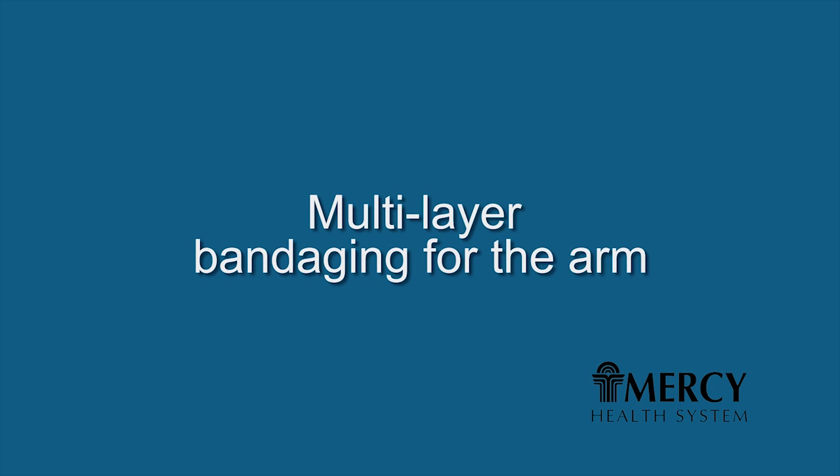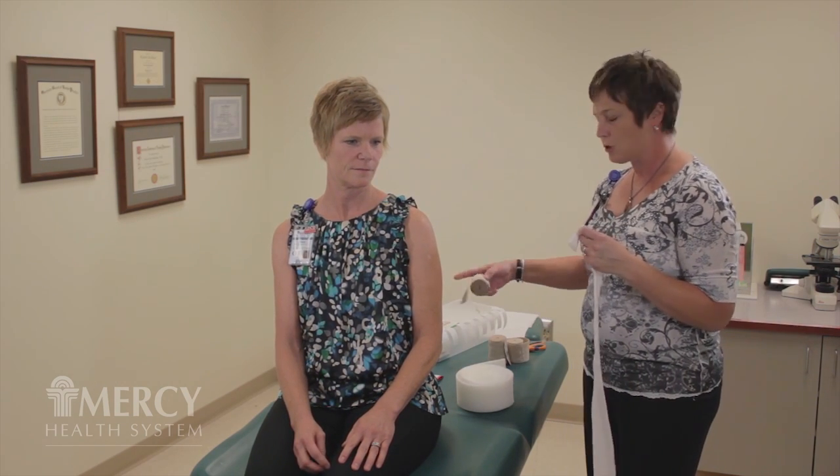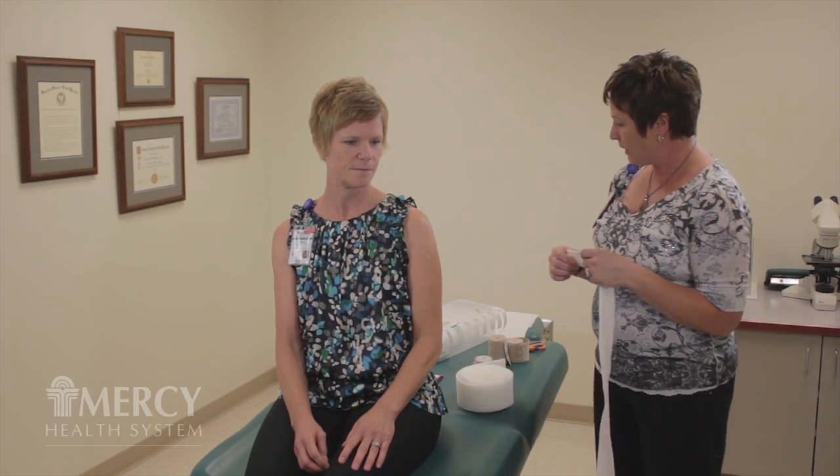What I'm going to do is show you the most commonly used bandaging techniques for the arm so that you can better utilize them at home. First order of business is to have your supplies ready. In the case of the arm, we're going to use the stockinette, foam, and then whatever three layers of bandages we've determined were necessary for your care. The most important thing to have ready when you're bandaging is your tape, so have your tape all cut and ready to go.